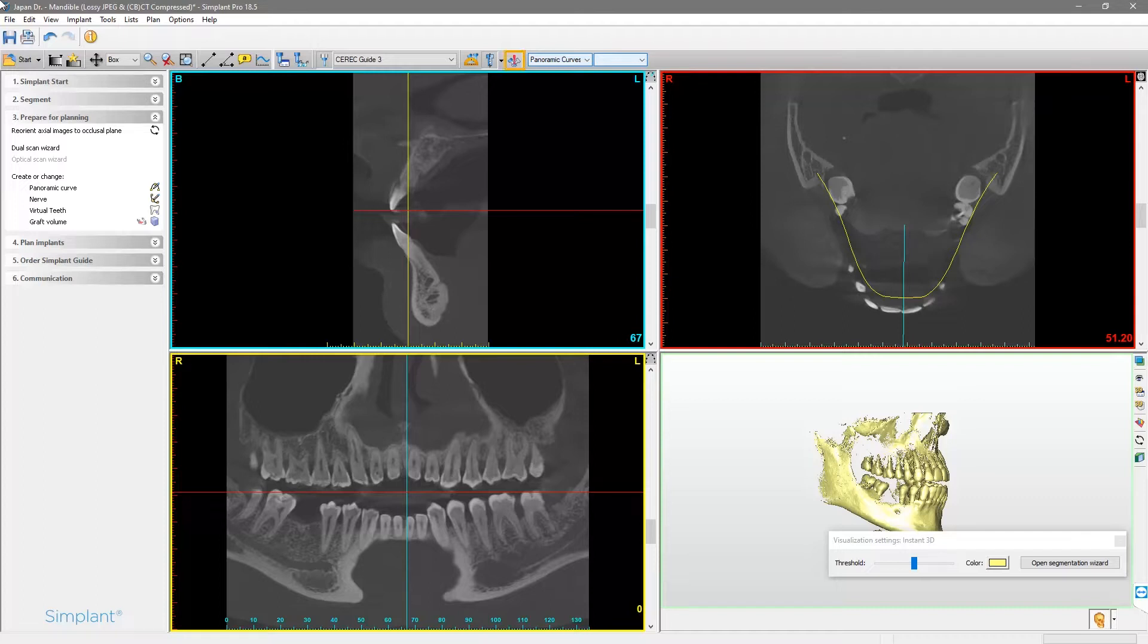For this collision tool to work well, it is very important to draw the nerve correctly. An incorrect shape of the nerve might result in a false sense of security, incorrect diagnosis, and poor treatment outcomes.